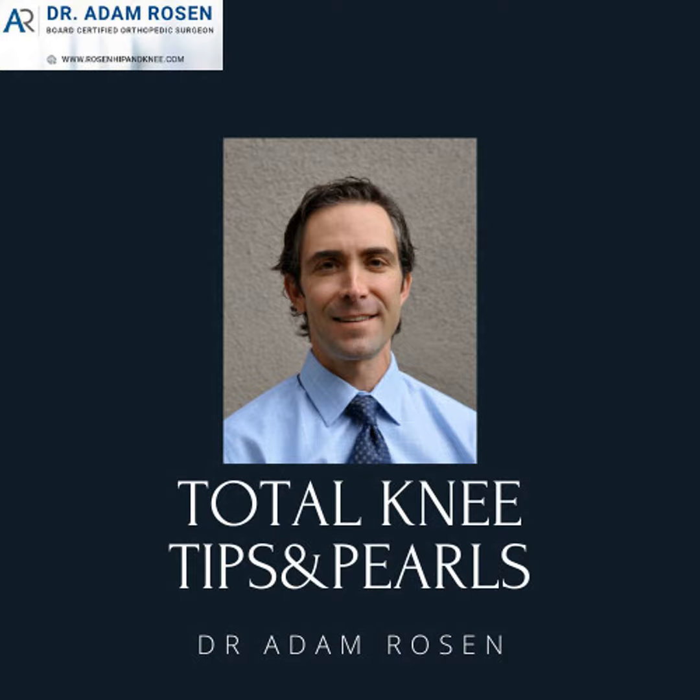Collaterals, tibial tubercle may be involved, may avulse. You may need allograft. You may need a hinge. You may need a DFR. So more information for you, kind of a quick listen before you run into the OR next time you're doing that big knee revision.